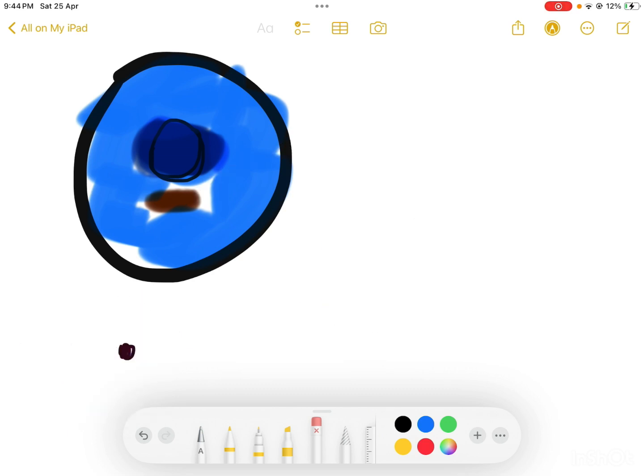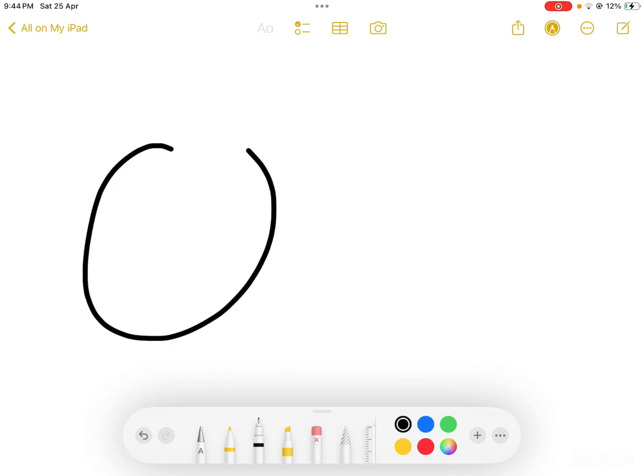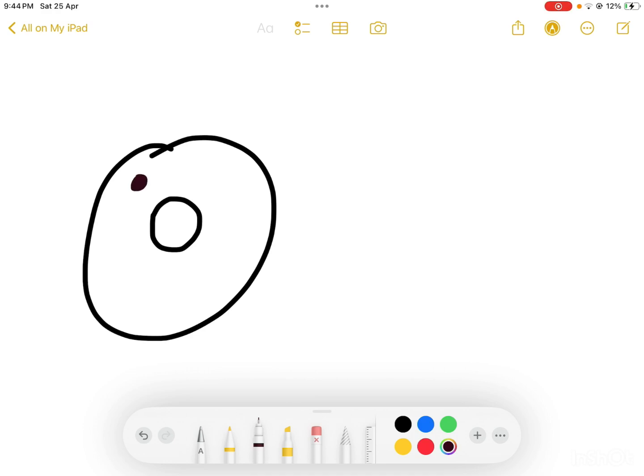Then the next pattern that we will be discussing is cell nucleus. So we said nuclear and cytoplasmic, nuclear plus cytoplasmic, cytoplasmic. Now dot like positivity. Now there is also something like cytoplasmic granular positivity, like this.